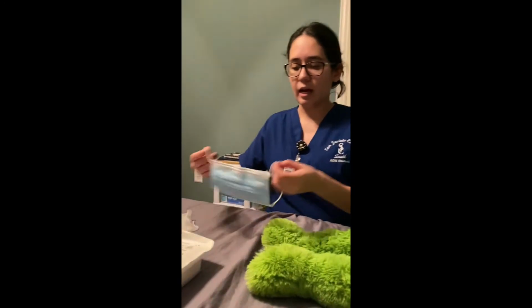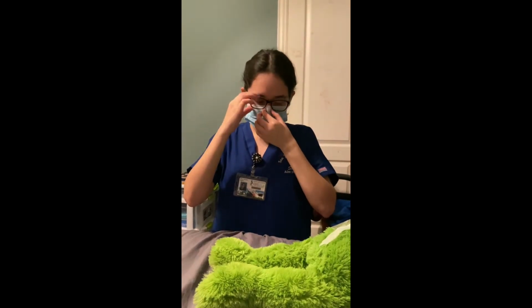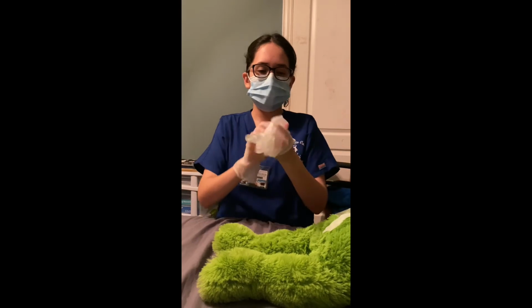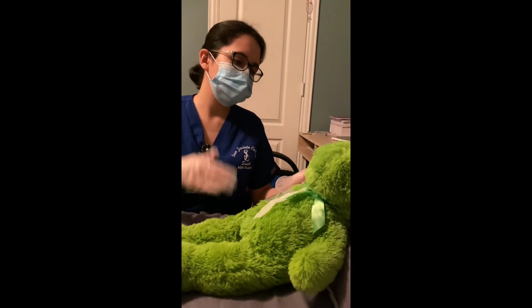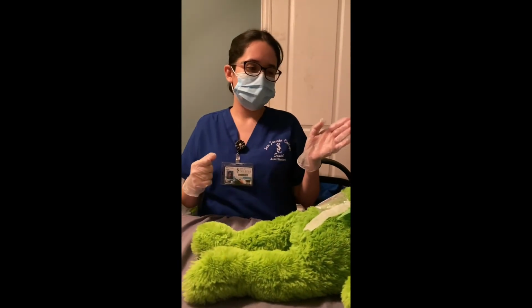I'm going to perform some hand hygiene and apply my mask. And these are my clean gloves. We're also going to have the patient turn away from the central line, just so that there's no contamination going into it. So Miss Jane, I'm going to have you turn towards the wall, okay, while I'm doing this dressing change, and I'll let you know when you're able to turn back. Okay, so the patient has turned her head towards the wall, and it's going to remain like that until we are done with the dressing change.